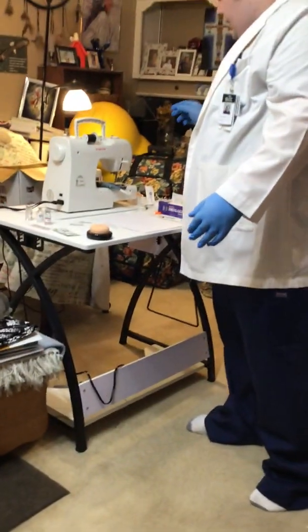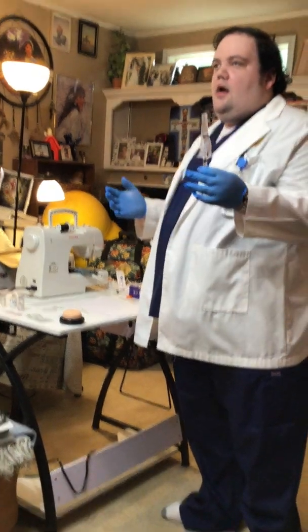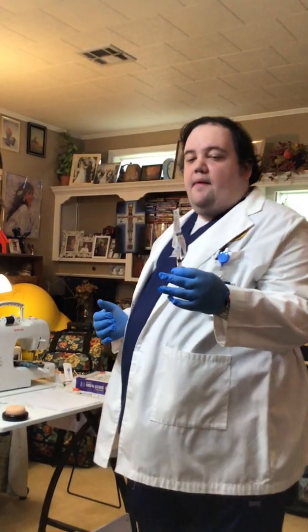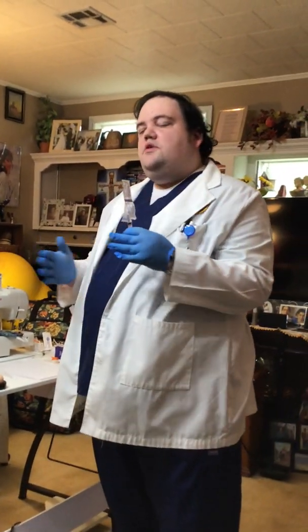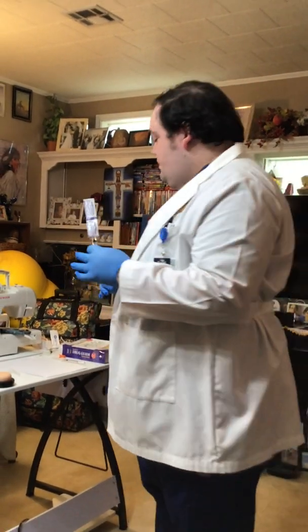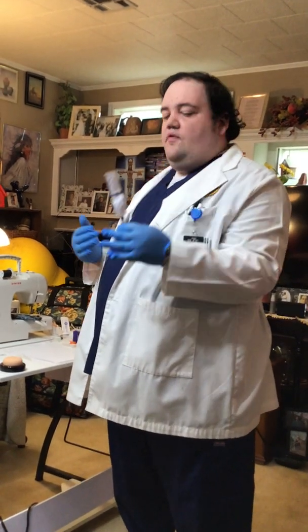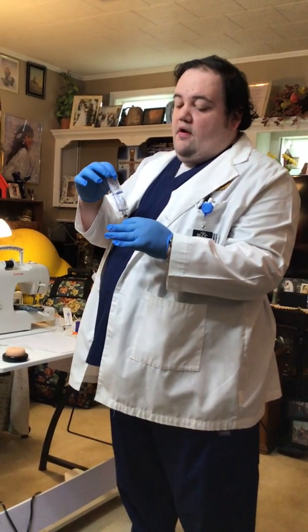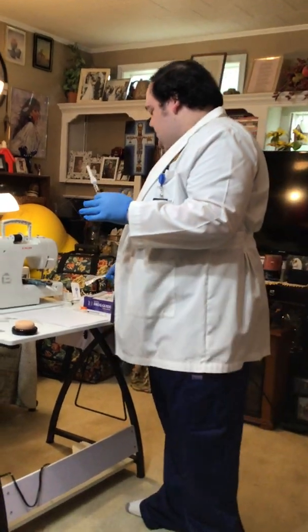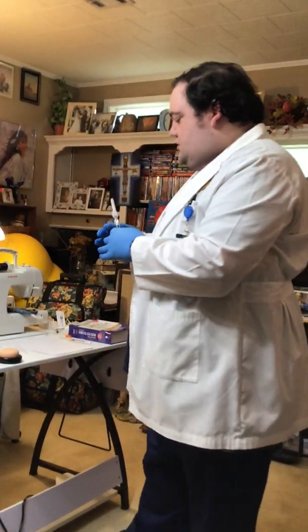Finally, the physician has ordered our dexamethasone shot. Now, I said earlier you want to try to label your needles so you don't get them mixed up, but if you don't have any labels, I differentiated this needle from the other one by keeping the cover on, so I didn't get it mixed up. So I didn't Z-track this one.